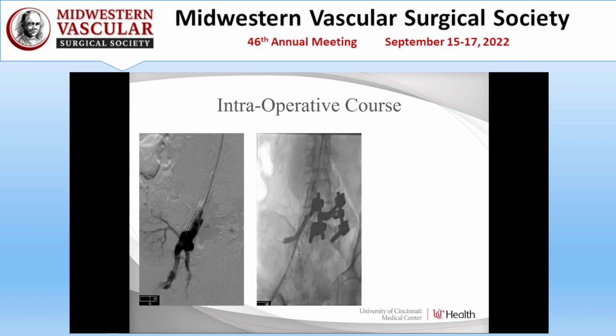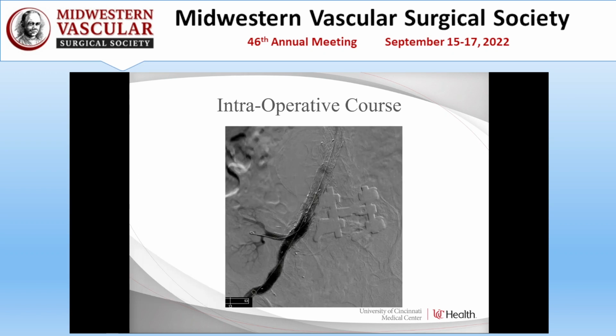We then came from the arm and cannulated that kidney artery and bridged that with the IBE with a balloon expandable stent graft. We then extended the other limb of the IBE into the external and deployed an iliac limb. This is our completion angiogram, which shows patent flow to the kidney and to the right lower extremity, and at the same time, successful exclusion of his aorto-iliac segment.